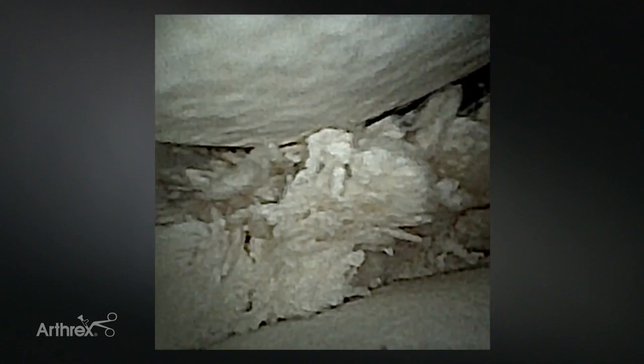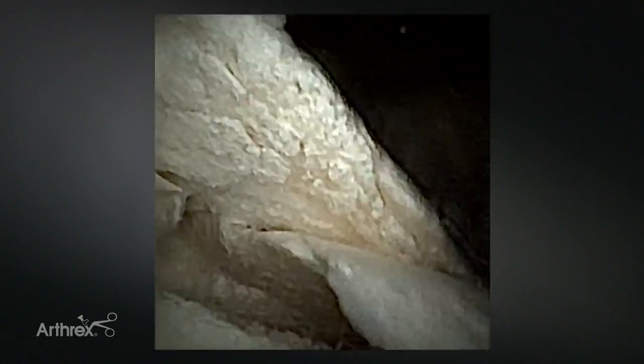I can see a large surface area of both the trochlea and the coronoid as it comes towards the back. As I back up, you'll see the radial head come back into view at the bottom of the screen, and I can actually drive across the radiocapitellar joint quite easily into the front of the elbow. Now I'm in the anterior aspect of the elbow, viewing with the straight camera.